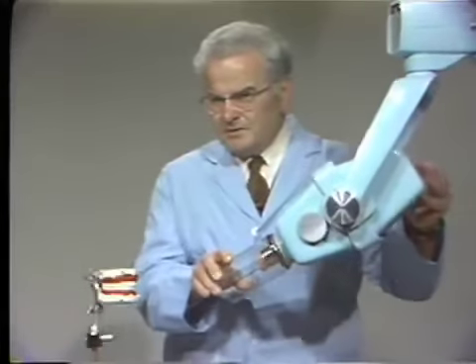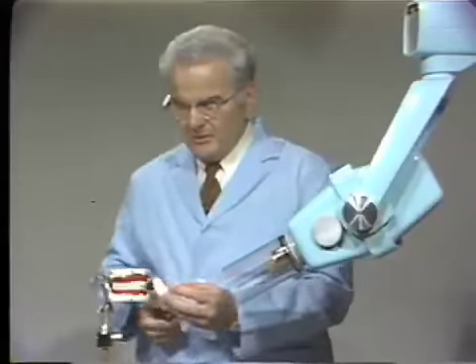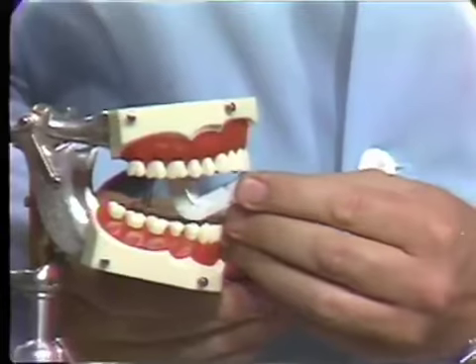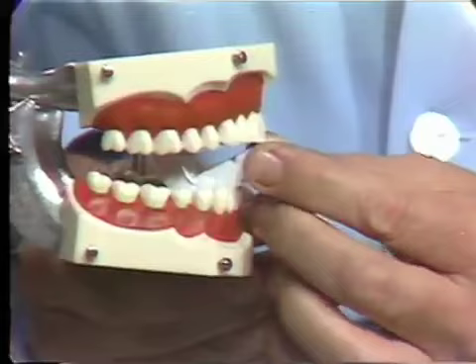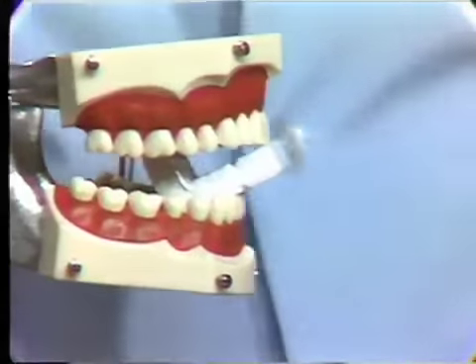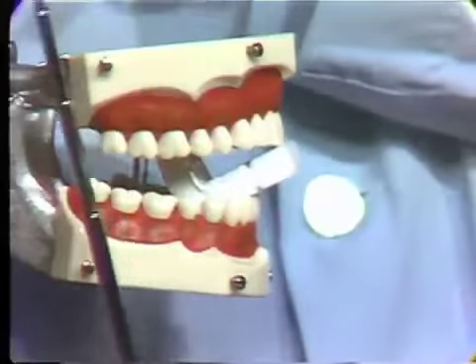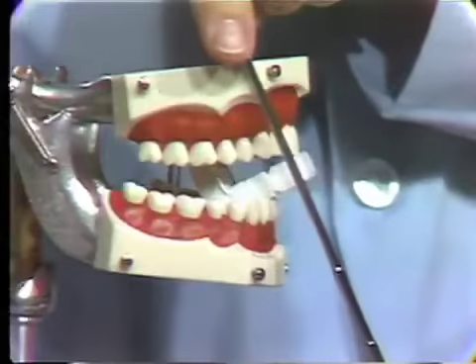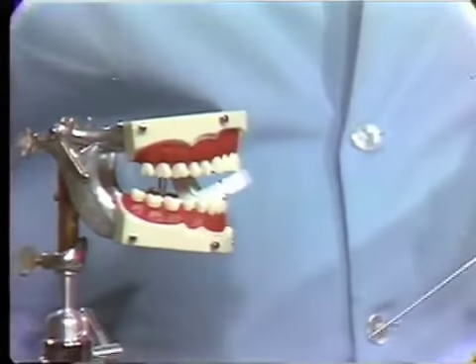Now I want to take the film packet and place it in the patient's mouth. The top of the packet rests against the roof of his mouth. The biting edge of the teeth touch near the end of the block. There we can see the long axis of the film and the long axes of the teeth are reasonably parallel, one to the other. Now I want to determine the proper vertical angulation.